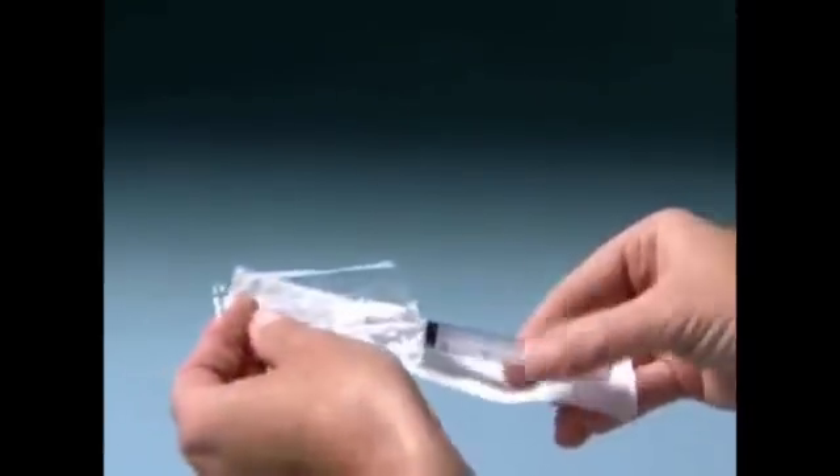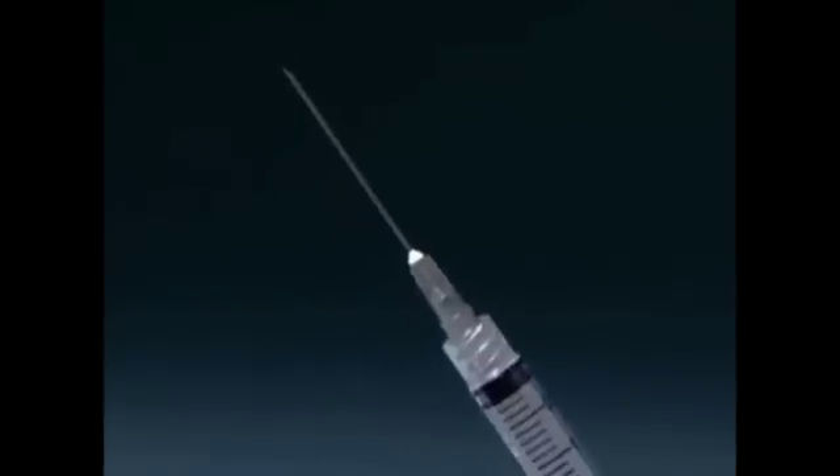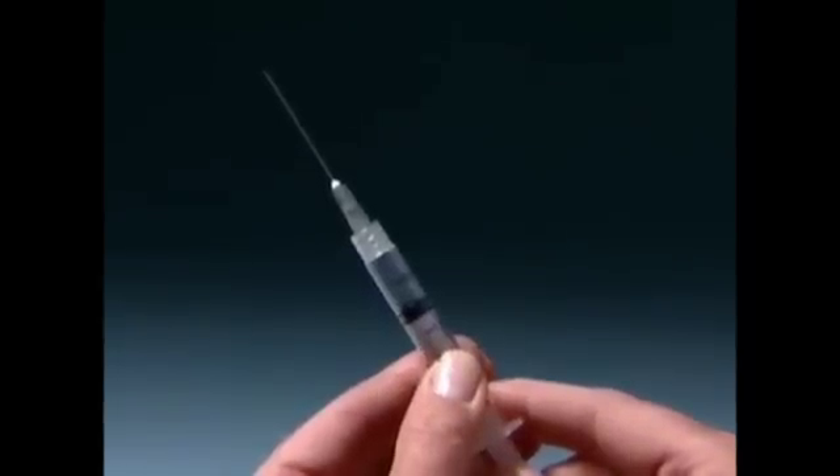Remove the wrapping from the syringe. Carefully pull or twist off the needle cap. Draw air into the syringe by pulling back the plunger as far as needed to withdraw the milliliter cc dose of progesterone in oil that you've been instructed to take. Place the vial on a hard, flat surface.